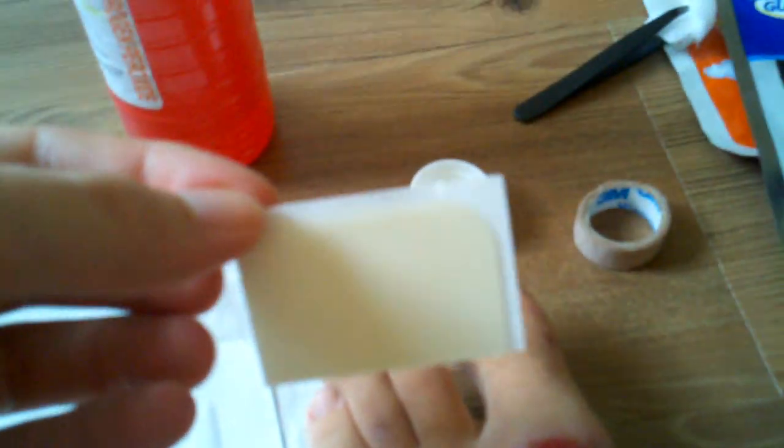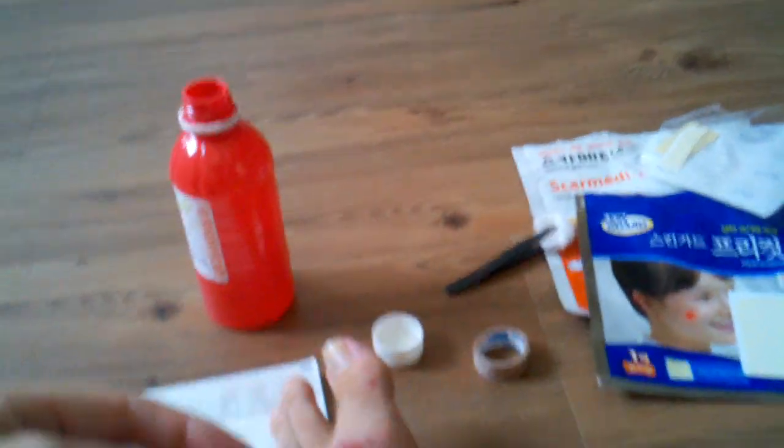Make a nice chunk of that. You see, it's about that size. Just cover the wound nicely. This stuff peels off, kind of like sticky tape. So what you want to do is you peel it off.